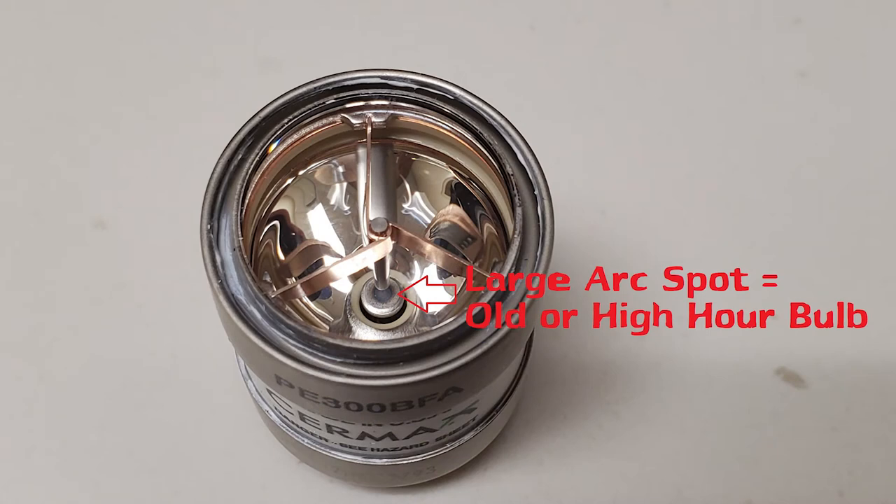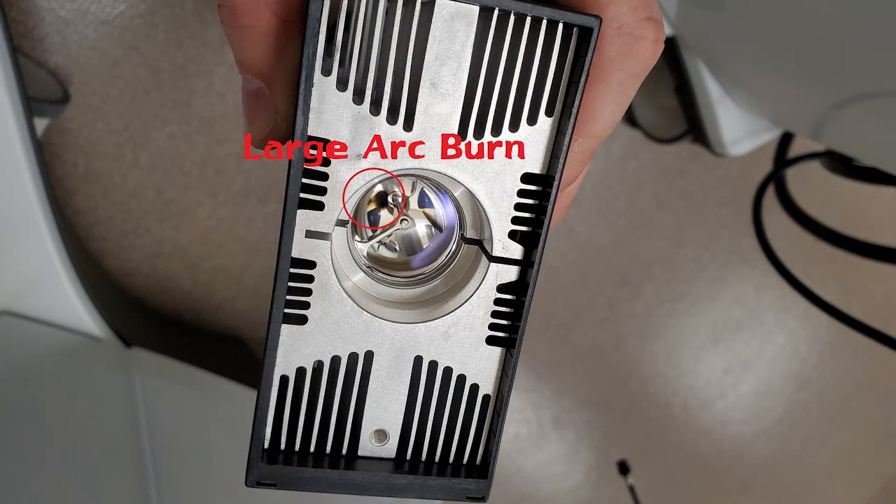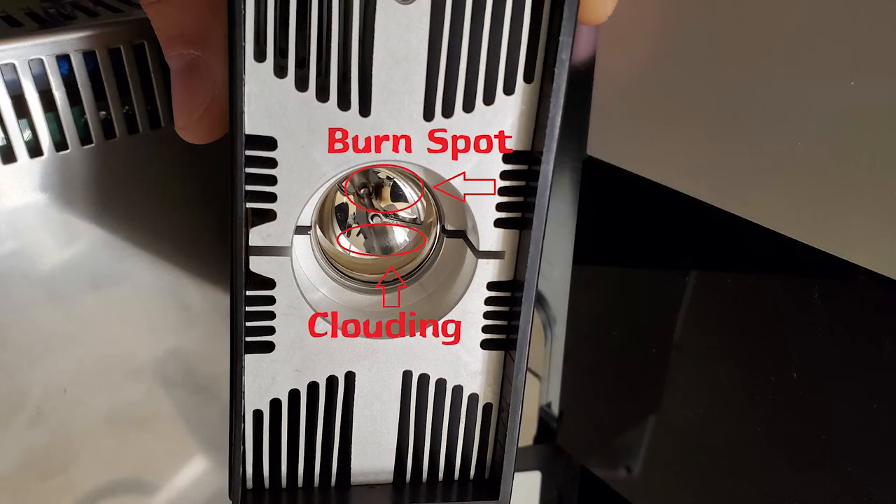Here's a close-up of that older bulb — notice how large the hot spot is. This bulb was about 500 hours into use. Here's one of those anomalies I mentioned: a large arc burn that has discolored and permanently damaged the parabolic reflector. This will only get worse until the bulb catastrophically fails. If you look very carefully you can see the start of a parabolic reflector burn. This bulb also has two anomalies — a burn spot and some clouding — both signifying it doesn't have much longer to live and should be changed soon.